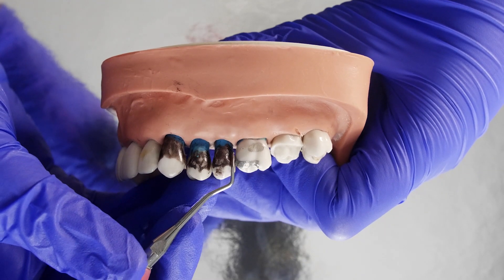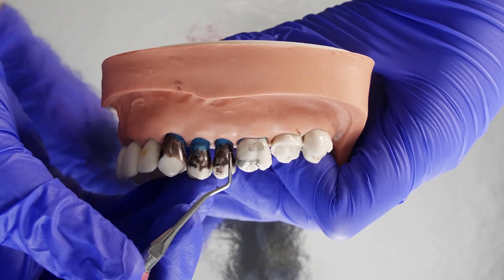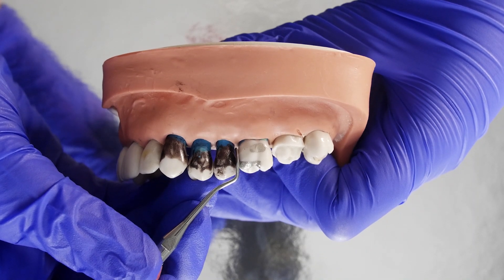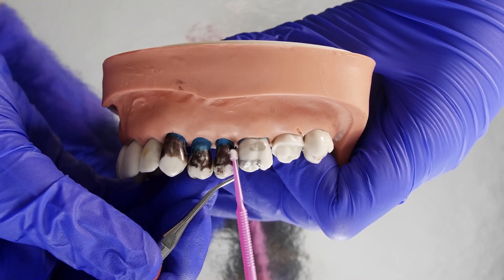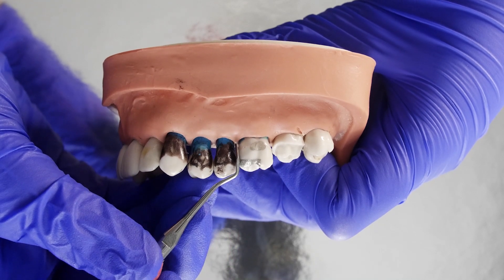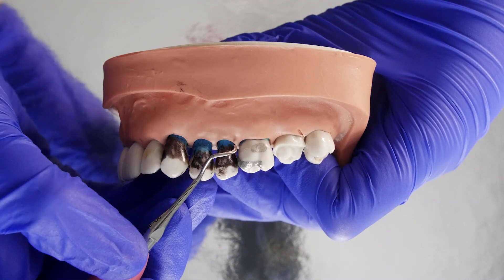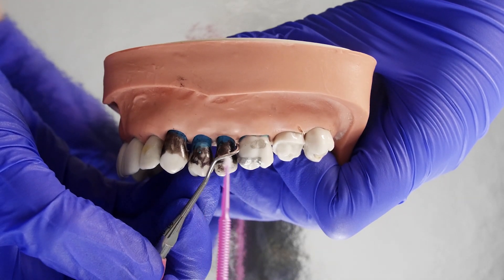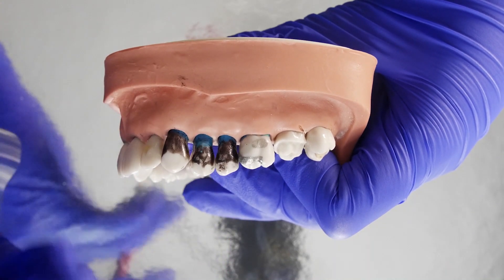Now we've got to figure out which is the correct working end. The way we do that is by putting the instrument against the distal surface of a posterior tooth, just like that. You can see that the lower shank is parallel to the distal surface of that tooth and the functional shank is coming up and over the tooth — this is correct. Let's see what the other side looks like. Hmm, that doesn't look so good. You can see that the shank is actually coming across the tooth, and in this position we simply cannot remove the calculus. So let's go back to the correct side.